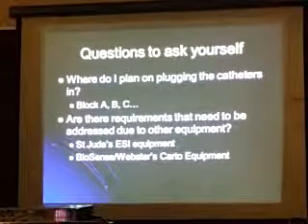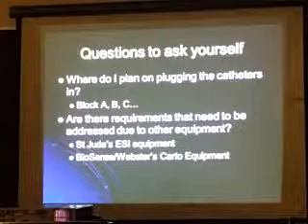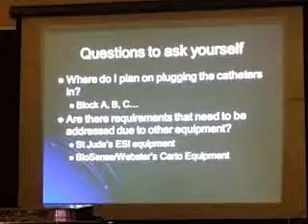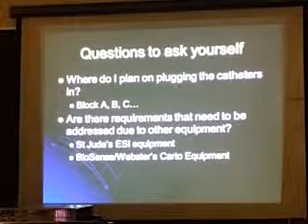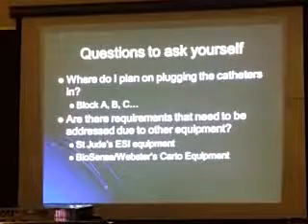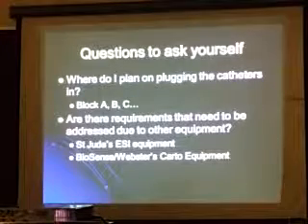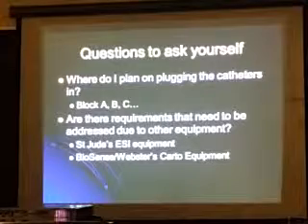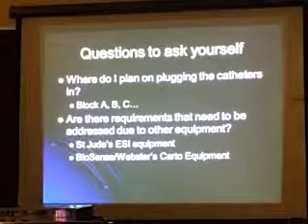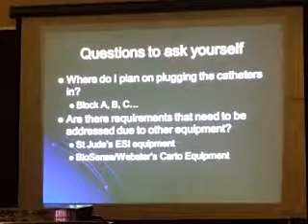Normally we don't pace in the His, even though I just picked on you about that. So it usually gets plugged in the same atrial channel. You see what I mean? Because it really doesn't matter where, 5, 6, 7, 8. Yeah, 5, 6, 7, and 8. And that way it sort of makes sense because it goes 1, 2, 3, 4, which is up on top, and in the middle is 5, 6, 7, and 8. And then we go to our ventricle, which is 17, 18, 19, 20, because it jumped over to another pacing channel. See what I mean?